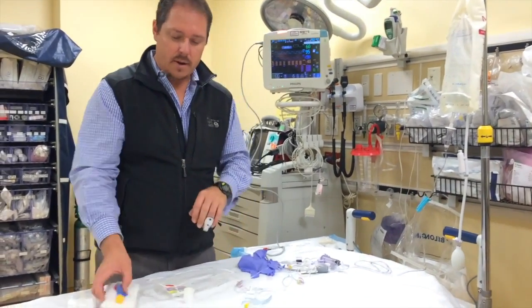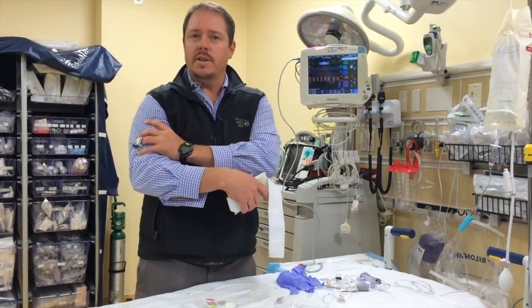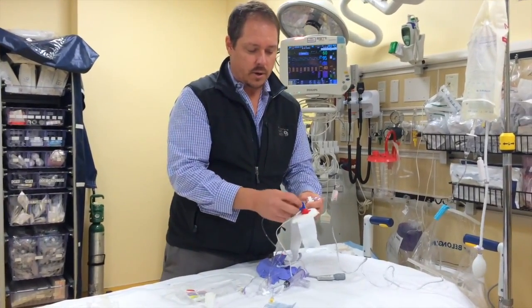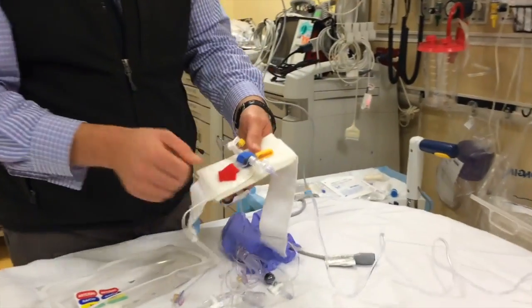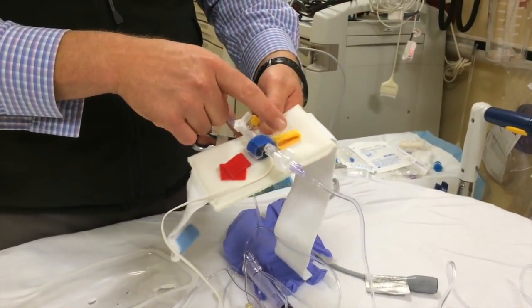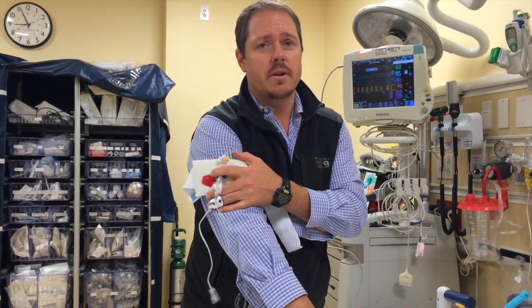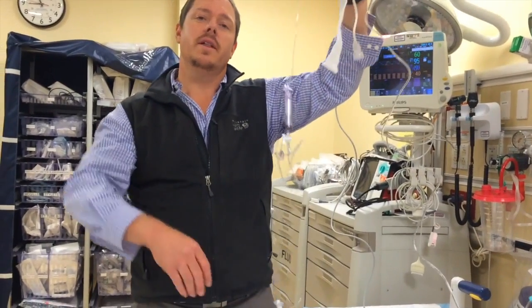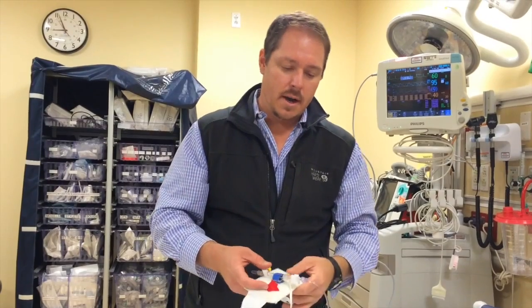I'm going to attach this to the patient. I would find the phlebostatic axis, which is the fourth intercostal space, mid-axillary line. The way we typically do that nowadays is we put the transducer itself into the transducer holder and then put it on the patient's arm, so it always stays in the same position. Red would be art line, blue is CVP, yellow would be like a Swan-Ganz or pulmonary artery catheter. The patient wears it like an armband, keeping it in a consistent position — which is important for zeroing, since any shift in position will give wildly different pressures.